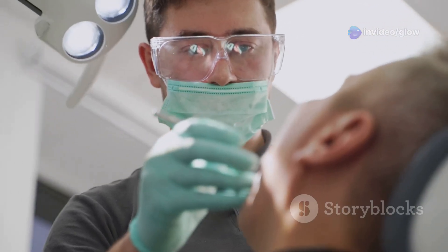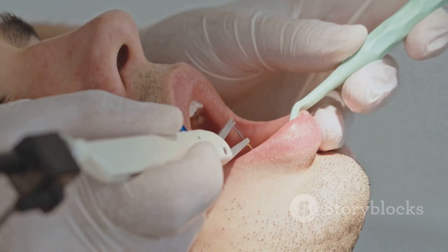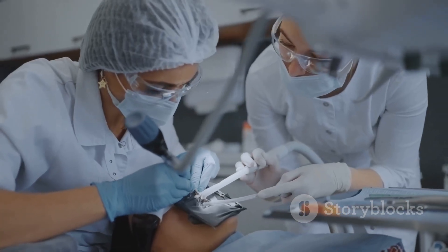Finally, step six: smooth out the cavity, clean it up, and check all your margins. Once everything looks pristine, it's time to fill.